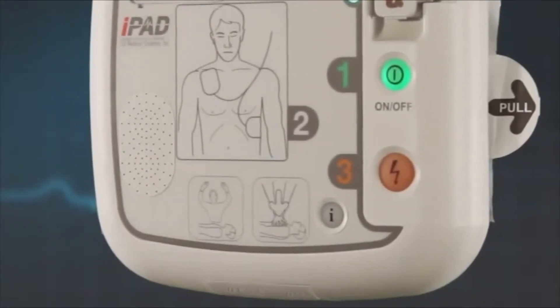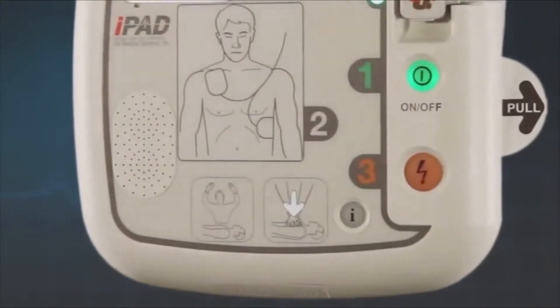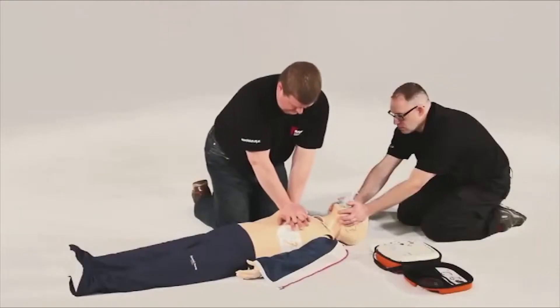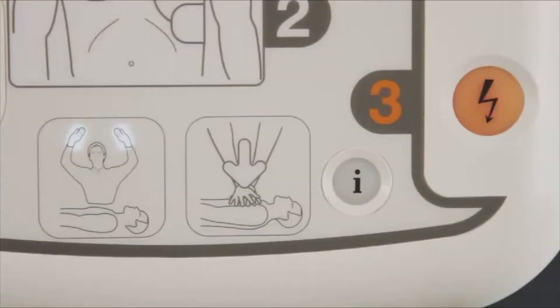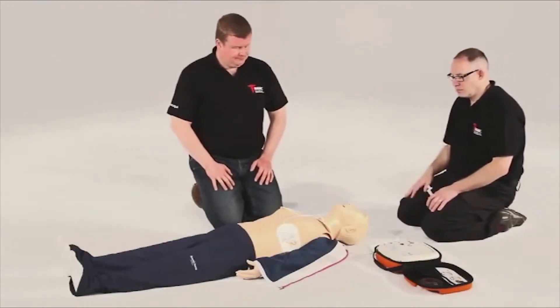The AED will also detect if CPR has been performed. Depending on what is detected, it will instruct either to commence CPR or encourage you to continue CPR. Always continue CPR until either the patient wakes up or the AED prompts you to stop so it can reanalyse. This is usually every two minutes.